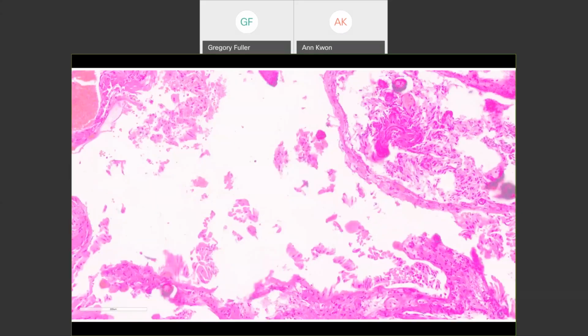And then finally, I've got Dr. Trivedi, olfactory epithelium. That's a very interesting guess. I like it, using data. Again, look at this. Now we have an area with less cautery artifact, right? So you have this dense collection of blood vessels, meningothelial cells, and this clearly epithelium. Dr. Zainab Harb, choroid plexus. Absolutely, this is choroid plexus.